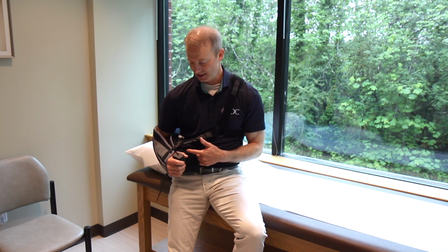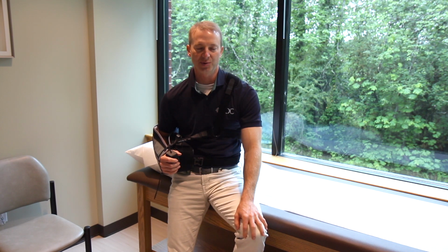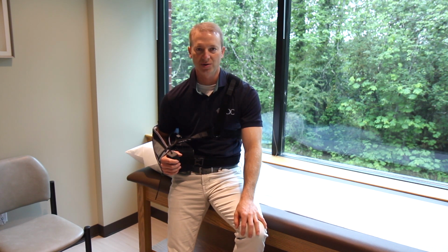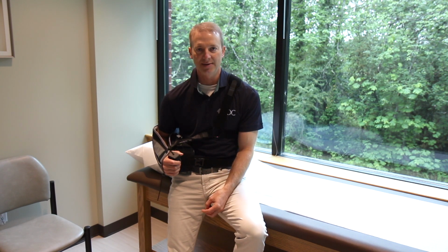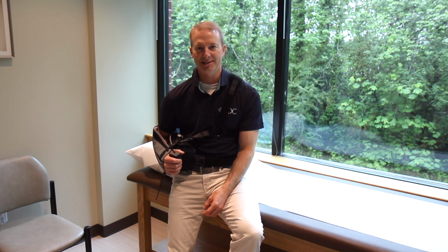After shoulder surgery, we typically will place you in a sling with a pillow such as you see here, and I get a lot of questions afterwards as to where to position the sling, how it should be adjusted for the most comfort but also to be the most supportive for the shoulder. And so I wanted to give you a demonstration as to where I think it should be worn and how it can be taken on and off safely to give you some ideas of techniques that might assist you.